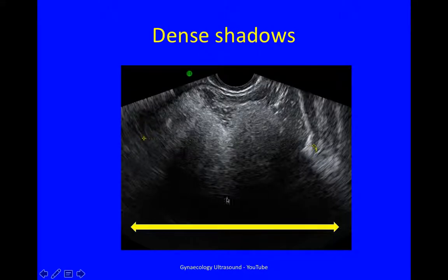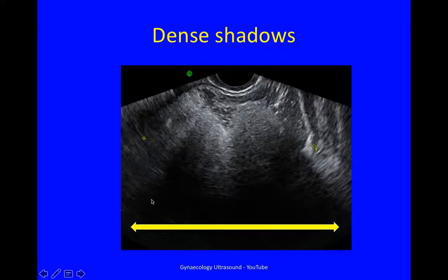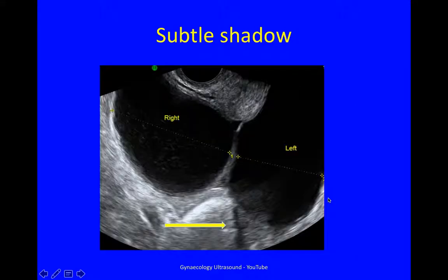This is an adnexal mass, and here you can see very dense shadowing behind the mass. This is a different lesion, and here you can just see some very fine shadowing behind.